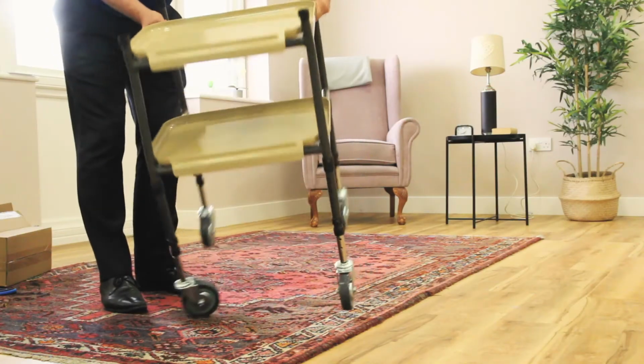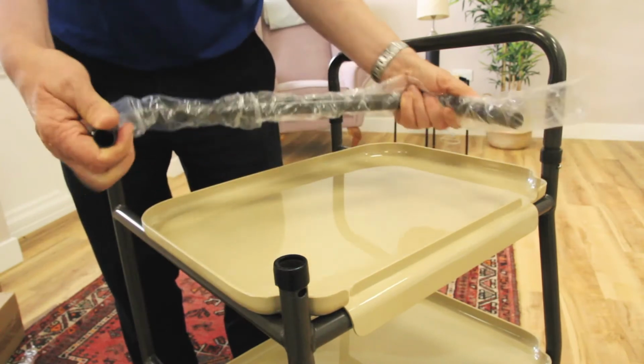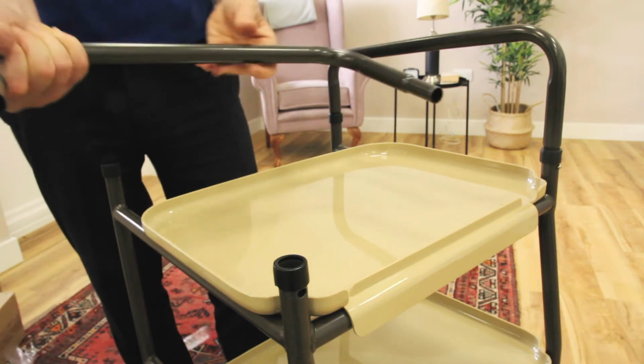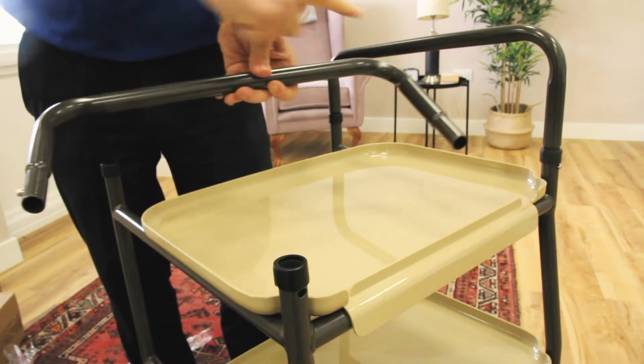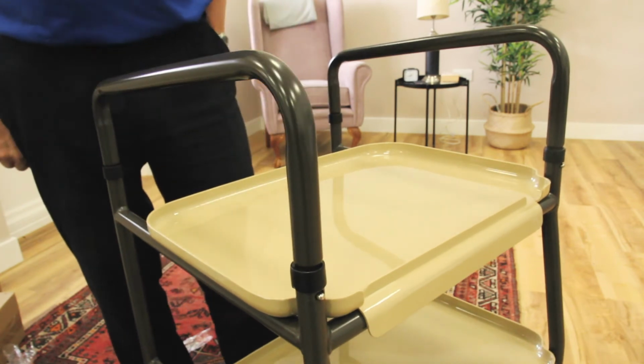You can now flip the trolley upright to attach the handlebars. Each of the handlebars has a higher and lower end to give the bar a slant. Make sure the lower end is closest to you when walking with the trolley so that you are able to push the product with a comfortable grip.